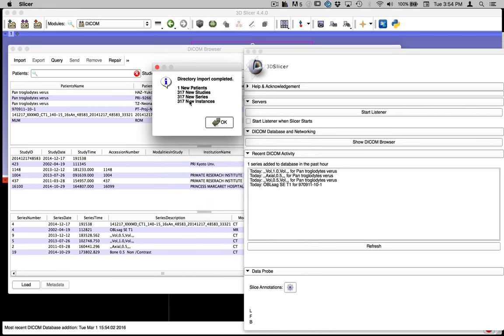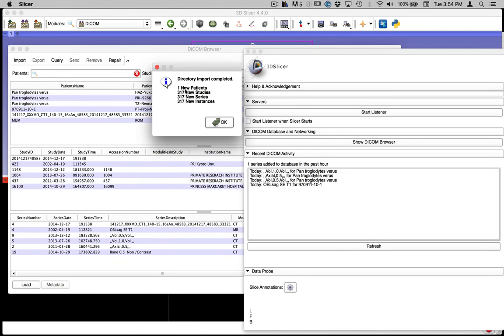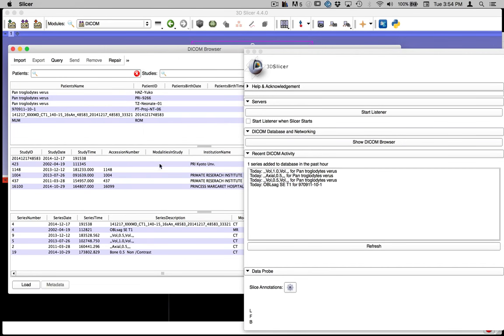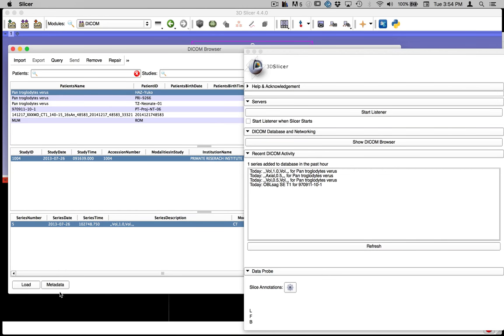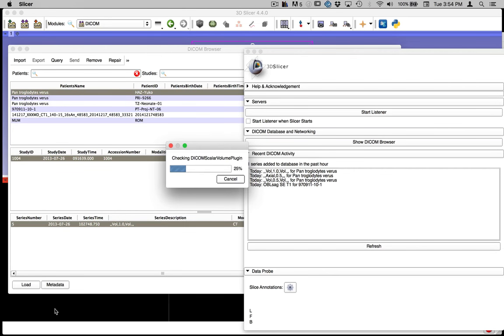So what it tells us is that we have one new patient. So this is medical imaging usually used for humans. 317 new study series instances. So these are the number of images or slices through the specimen that we have. Say OK. And you won't have all of these different ones here. You'll just have one. But this is Pan troglodytes versus the HAZ-Yuko one. And once I do that, you can see it just highlights a couple of things down here. And we can just load that now.